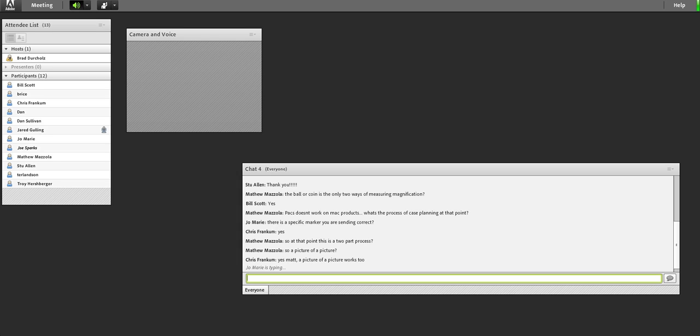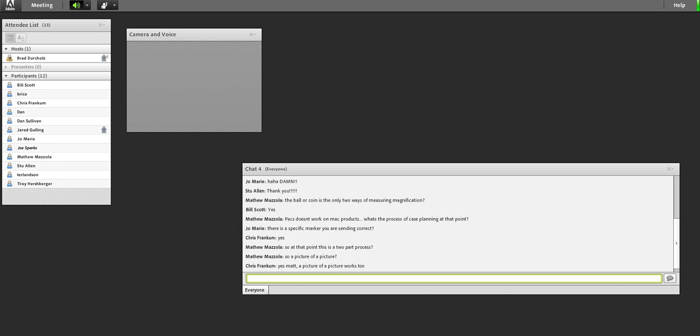Okay, and I was just confirmed too by Chris that the mag markers are actually 25.4 millimeters. So the 0.4 is critical, or else the whole system will crash. Kidding, of course. Any other questions from everybody online?